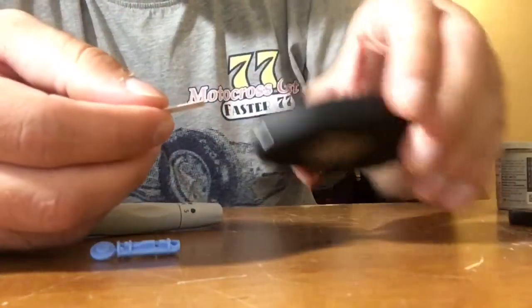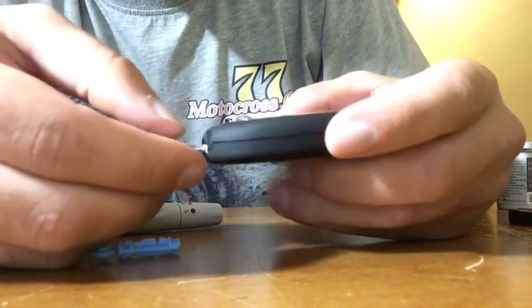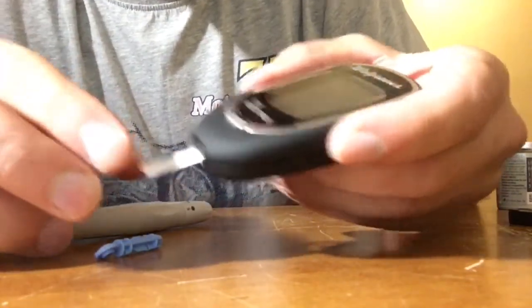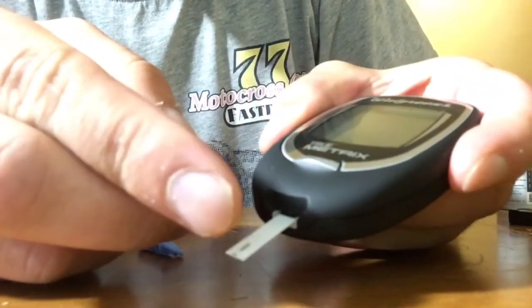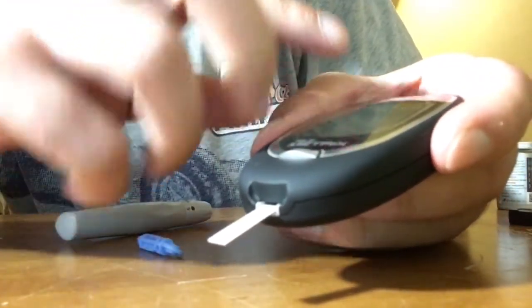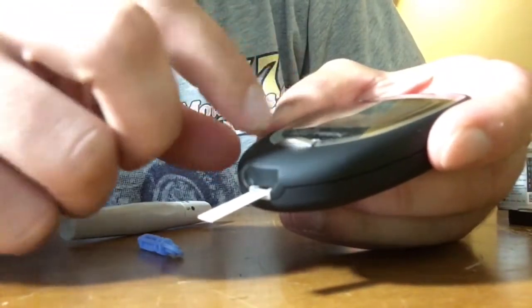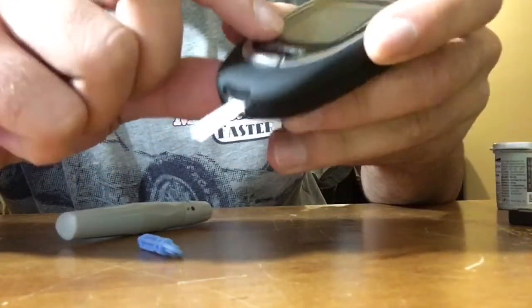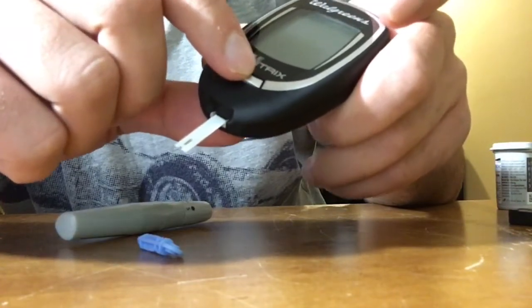Before that, you want to put the test strip into the meter a little bit, not all the way. Once you put your sample here, you can see the reading. Once it's ready, you push it in and the meter automatically turns on. The result will be shown in about four seconds, and once the result is shown you can push this button and it'll turn off automatically.